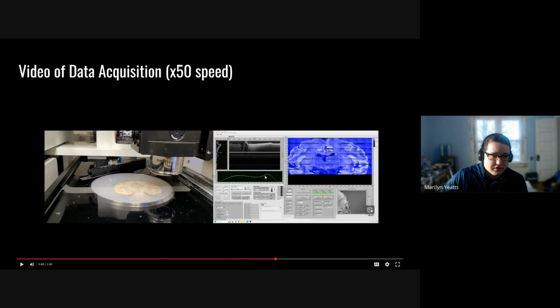This bottom part of the signal is not necessarily of interest to most people, but it's important for us. This is actually what our raw spectral data looks like. So this is actually what's being saved when I save data. This is the more comprehensible visualized version after we've done the FFT. But this is actually what our raw spectral data looks like, where you've got the pixel number on the camera versus the intensity. You can't see it because it's zoomed out, but what you're seeing is a general curve shape of what our spectrometer picks up, and then the variation on it is what the actual signal is.